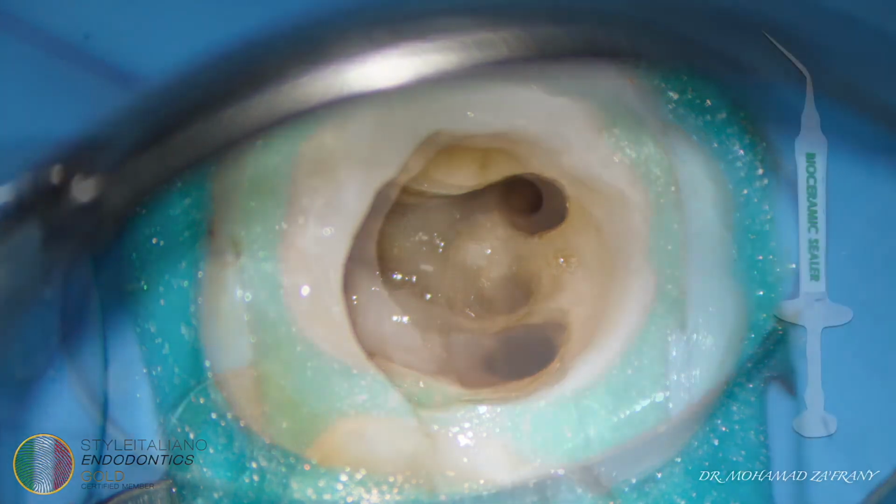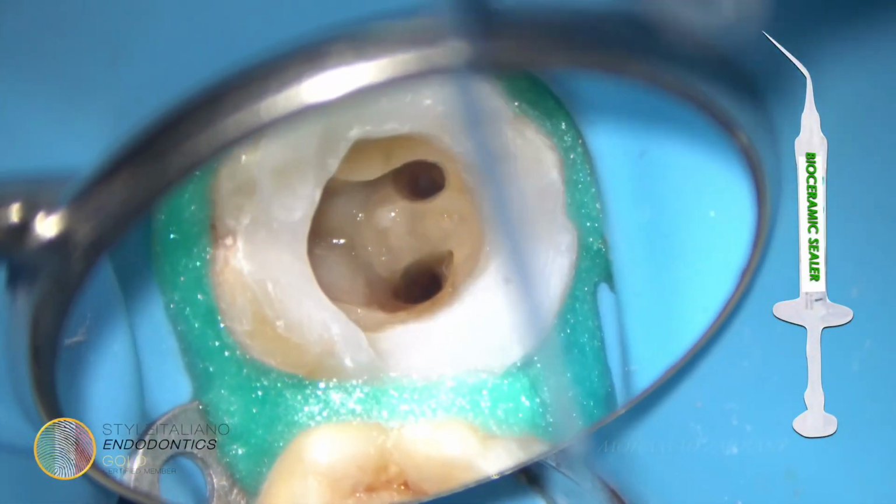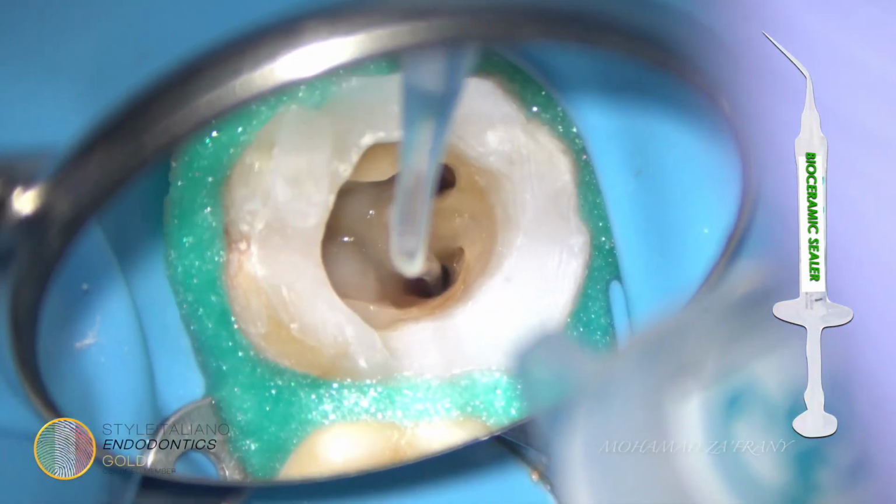Now I'm showing you injection of bioceramic sealer into the palatal canals, and we can clearly see filling of the isthmus in between the two canals.